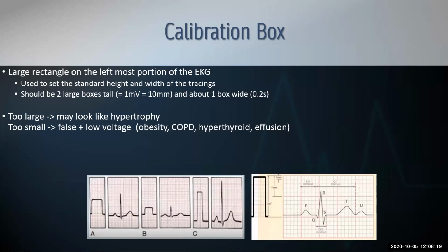We had a patient last week who had a pericardial effusion without tamponade physiology. And that was one of the things I told the team I first looked at, on top: the calibration box. I wanted to see if this patient met low voltage criteria, and they did. So that's kind of interesting, being able to apply it clinically to someone.